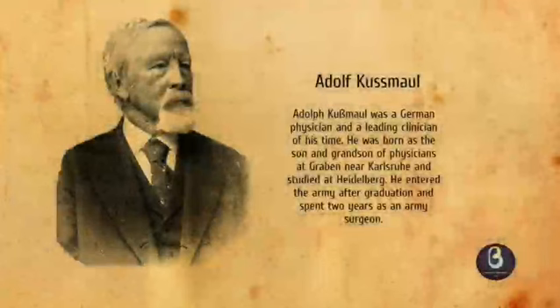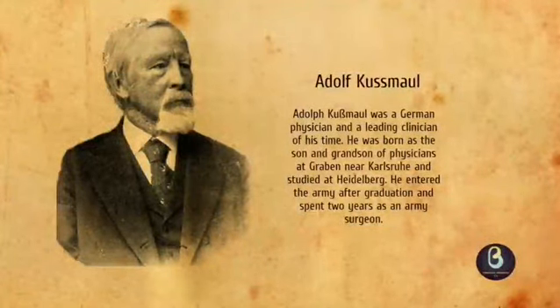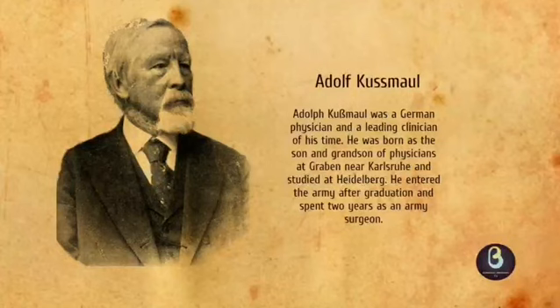After a series of trials, Dr. Adolf Kussmaul of Germany succeeded in taking a look inside the stomach of a living human body for the first time in 1868. This was tested on a sword swallower who could gulp down a straight 47-centimeter long metal tube with a diameter of 13 millimeters.